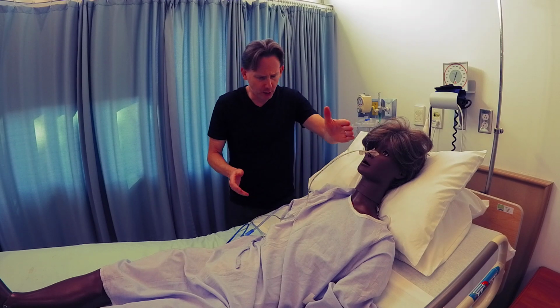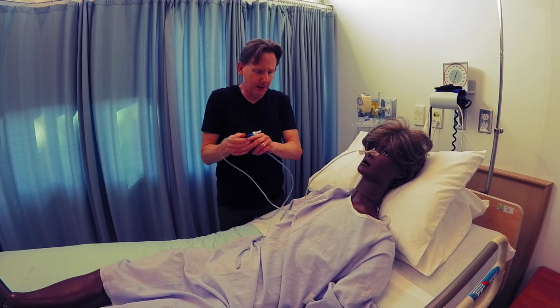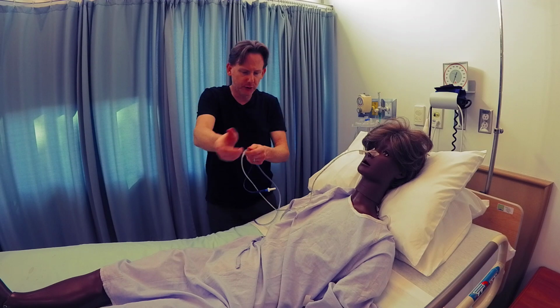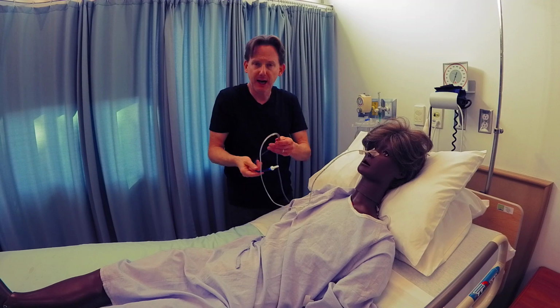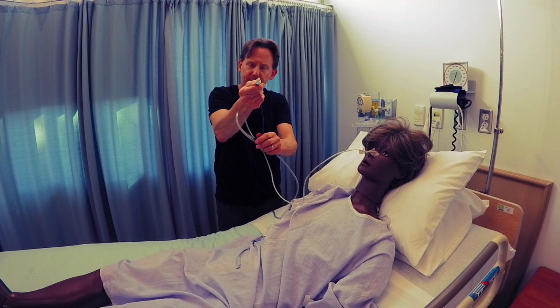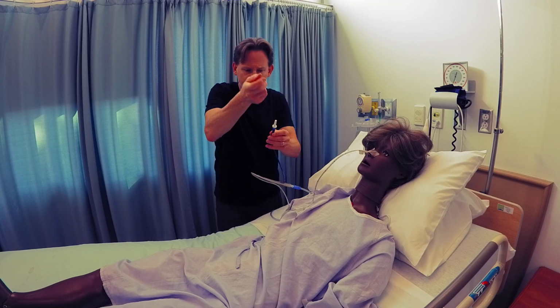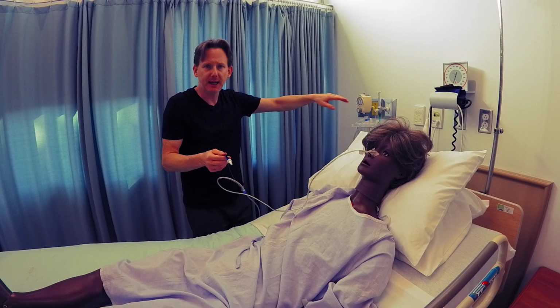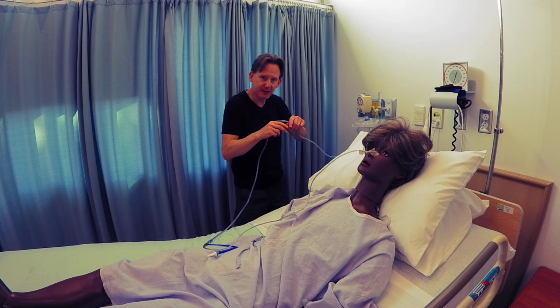The second thing that could be going wrong is, as I talked about in another video, there could be kinks in the line, so look for those. If it's kinked, unkink it and see if you get flow through and see if they feel relieved. Another issue could be that this air adapter is being put on the wrong way. If it is, you put on a pair of gloves and simply turn it around. If that's the problem, you'll get NG flow immediately and they'll feel relief. Check to make sure everything's connected and nothing's kinked.